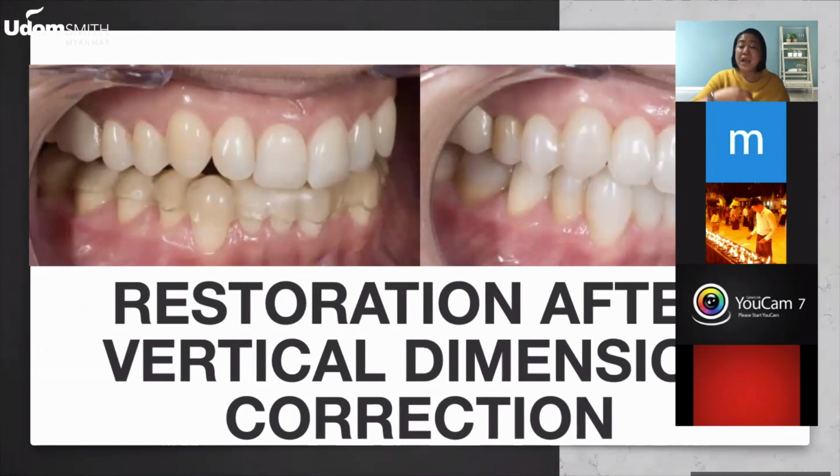Now, another is when you do a splint treatment in your patient. Of course, after your patient uses the splint, there will be a space that will be created because you increase the vertical dimension. And that space that is created by the splint to correct the bite of the patient can be closed by Edelweiss. See, a majority of the time before, we tend to create a crown instead. So look how invasive our treatment is. The patient just wants to correct the bite, but because we created a space in between to correct the bite, we now have to destroy or damage the natural tooth to close that space.